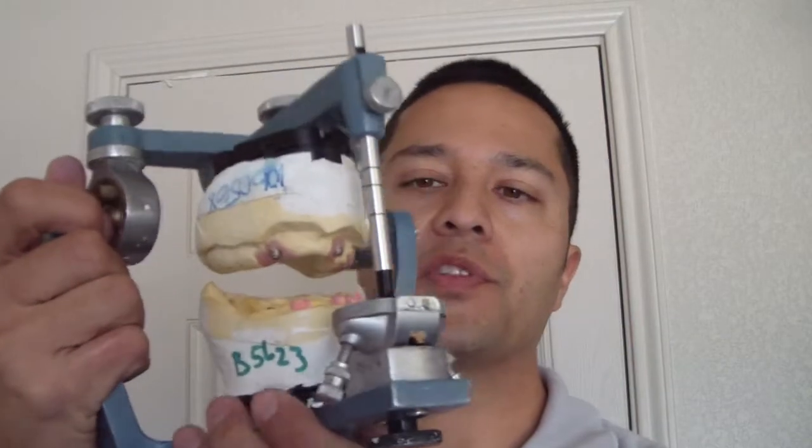Interesting situation — this is approximately a 50-year-old female with a chief complaint of not liking her denture the way it is right now. She relates a history of orthognathic surgery due to a cleft palate, back in the mid-80s, and in the 90s she had a number of implants placed.